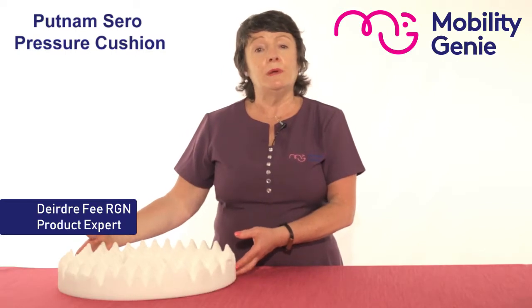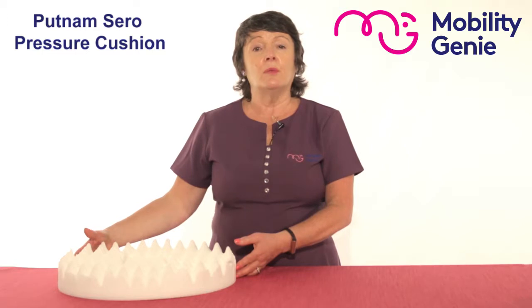At Mobility Genie we recommend the Putnam range of pressure relieving cushions. They're made of a high density foam, they're affordable, reliable and recommended.